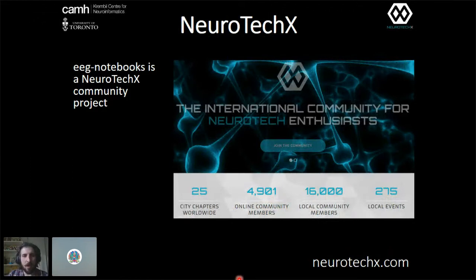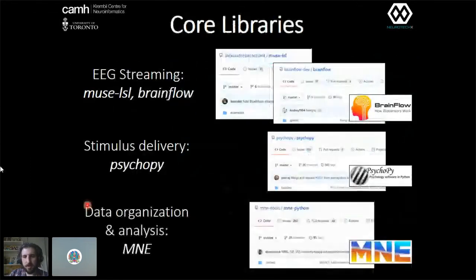Now let's get into the nuts and bolts of EEG Notebooks.